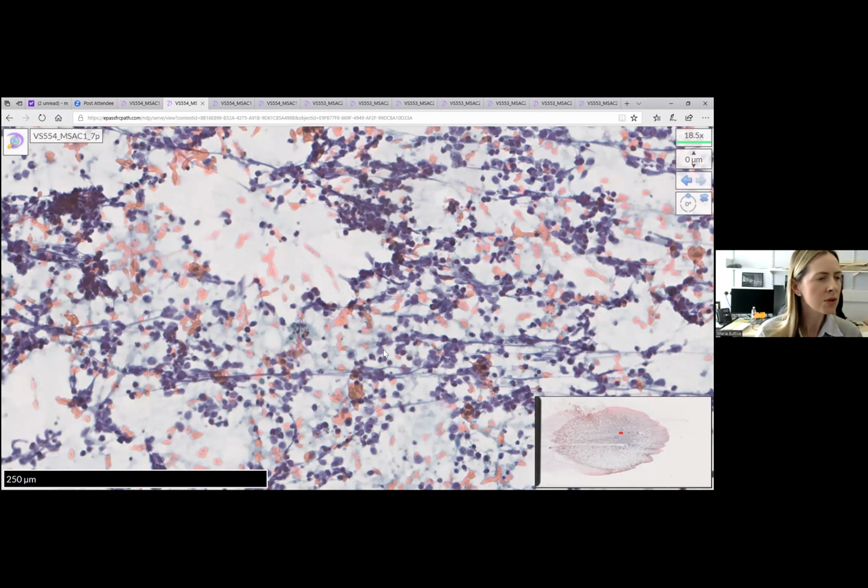So you could do some neuroendocrine markers such as CD56, synaptophysin, or chromogranin. You could also do an epithelial marker such as CAM5.2 or AE1/3, and that often shows perinuclear dot positivity in small cells. And you could do a TTF1, which is commonly positive in metastatic small cell carcinomas of lung origin. And then if you do a proliferation marker, such as a Ki67, these will invariably be high.